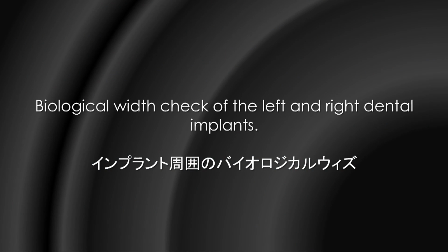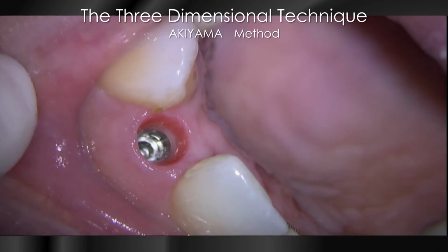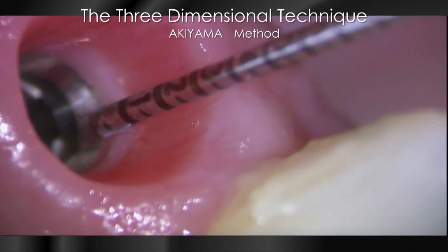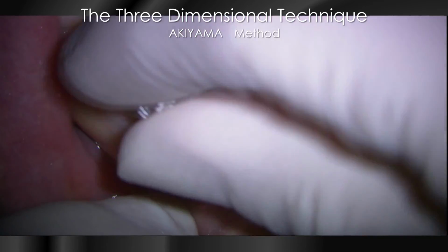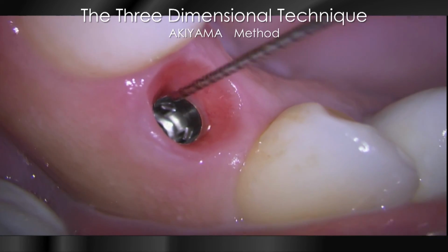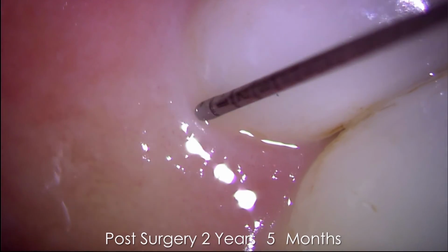Biological check of the left and right dental implants. This is the right upper lateral incisor area. We will check. Very beautiful and healthy condition. This is the left upper lateral incisor. Same, good condition. Beautiful. This is post-surgery 2 years, 5 months. Very good, beautiful and very healthy.